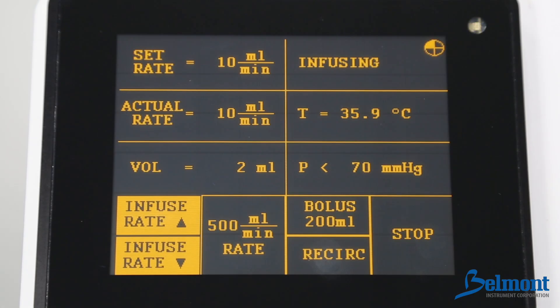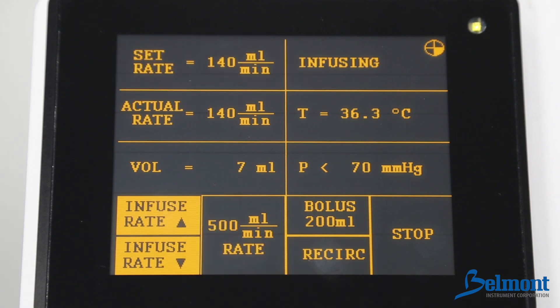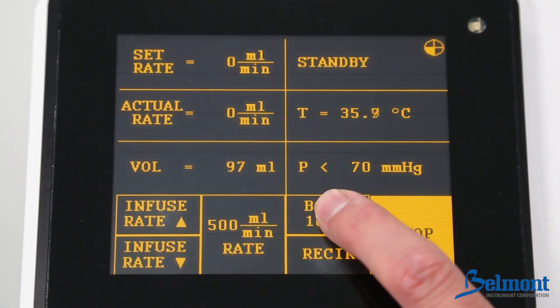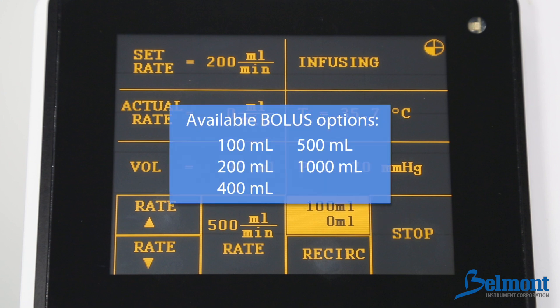Press the up and down arrows to increase or decrease the infusion rate. Press and hold to change the rate quickly. Fluid will be precisely warmed at all infusion rates. You can press the stop button at any time. Pressing the bolus key will deliver a specific volume of fluid. The volume delivered will be displayed on the lower half of the bolus key until the bolus operation is complete. Available bolus options are 100, 200, 400, 500, and 1000.